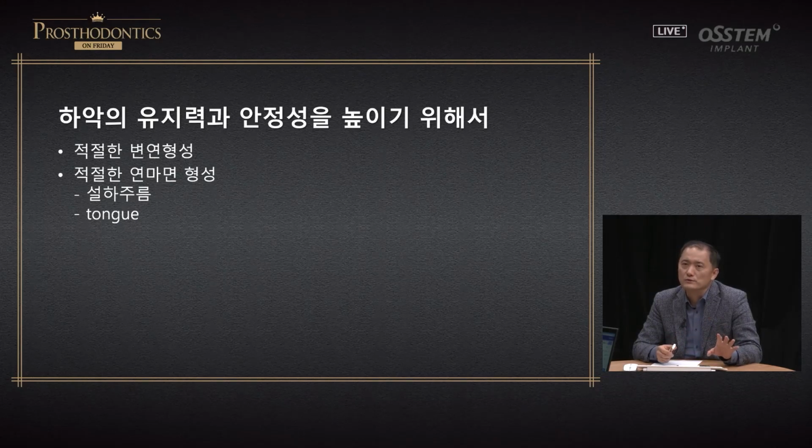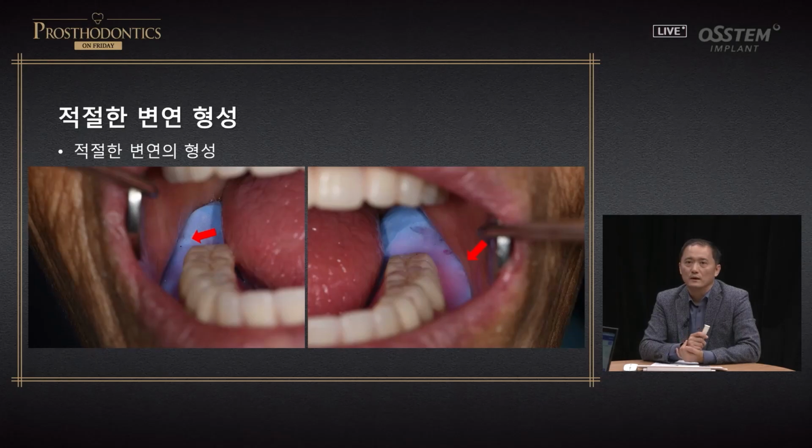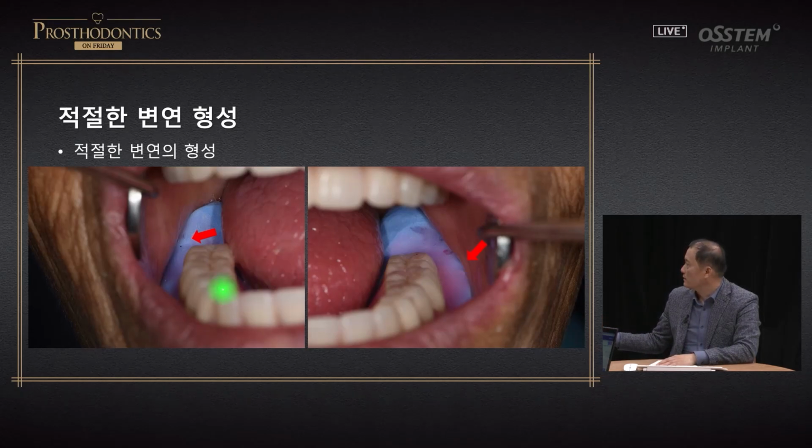Or, even without stability and support, is there a way just to increase retention? So for this severely resorbed ridge, what would be needed? It's the same as on the maxillary side. It's a very sensitive area, so even a slight extension could be a problem. You have to be really cautious in forming the surface. Let's look at the border molding first, same as before. Here, you have a bit of a push.